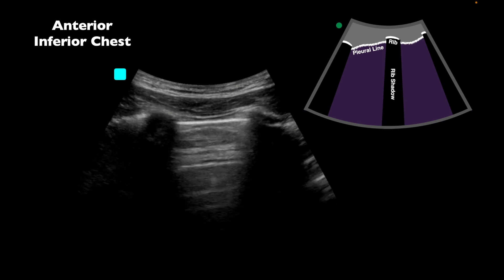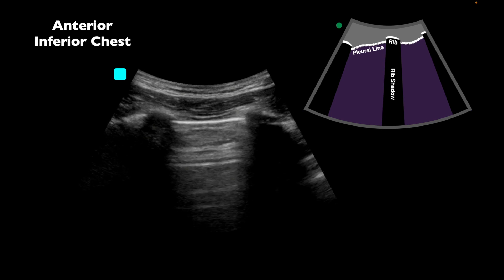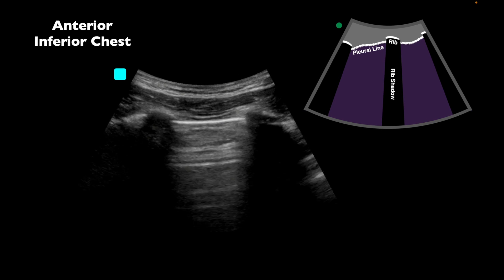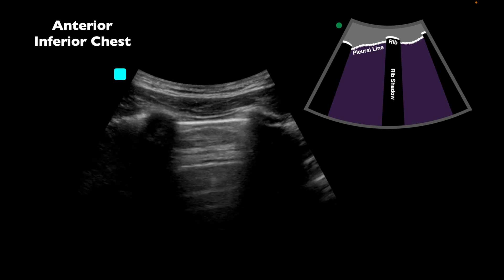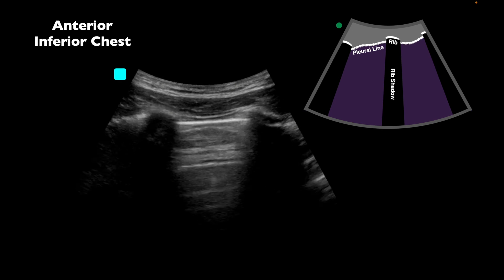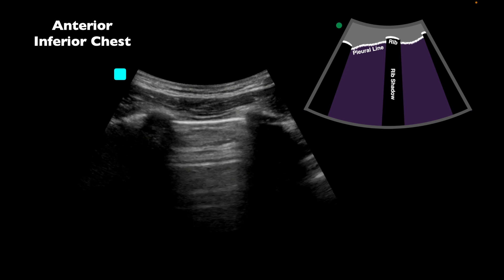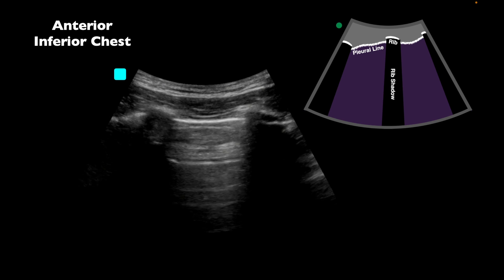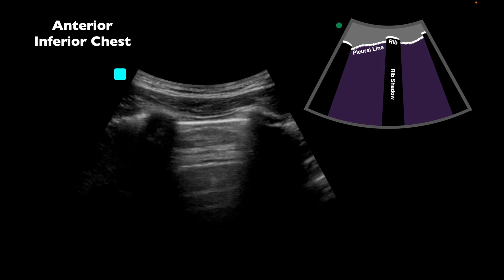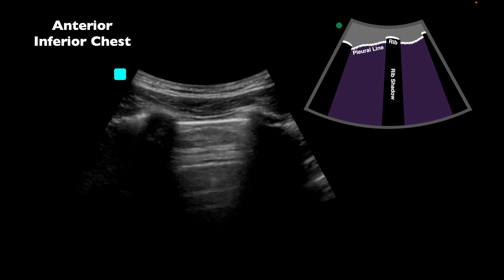There's nothing too exciting about the lung views. What I do like is that because this is not undifferentiated shortness of breath, the depth was kept really shallow and they were able to clearly visualize lung sliding. This is representative of all the images taken on the anterior chest. I really like that they focused on the pleural line and were able to confirm lung sliding was present.